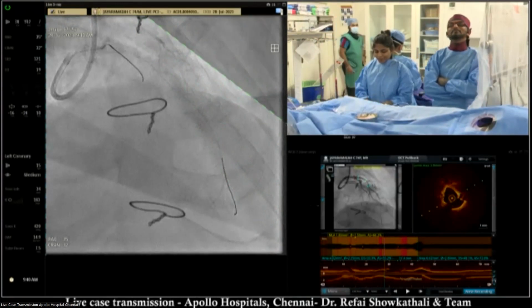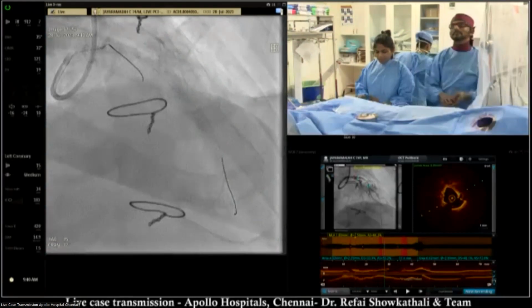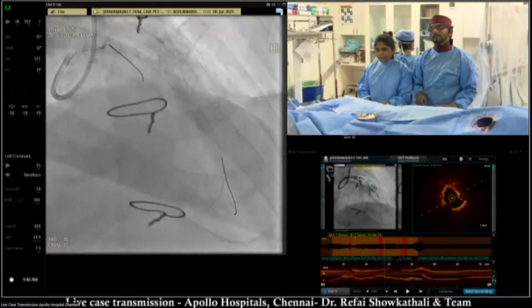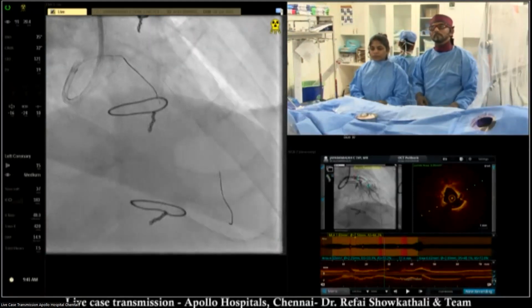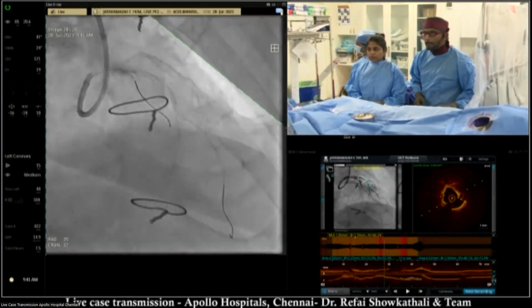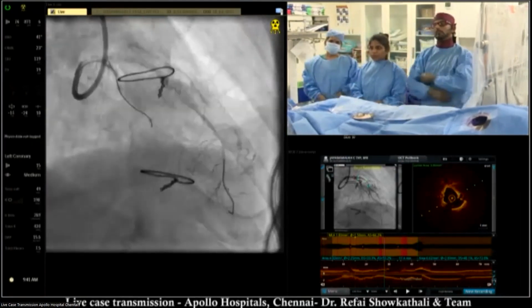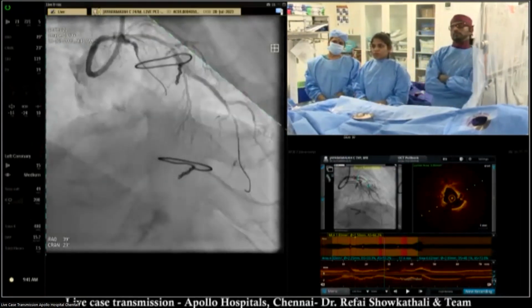Madam, actually, in this case, a lot of devices are available. You just go to the atherectomy part. That is why I asked about the score. If the score is more than 3, then you have to go to atherectomy. It can be orbital atherectomy or rotational atherectomy. If you use a balloon, you have multiple balloons available, not only cutting and scoring balloon. You have OPN balloon available, you have IVL balloon available. So these are the 3 things available now.